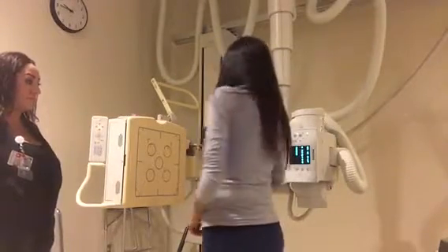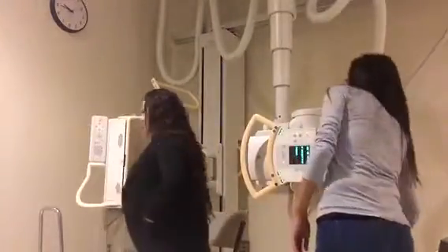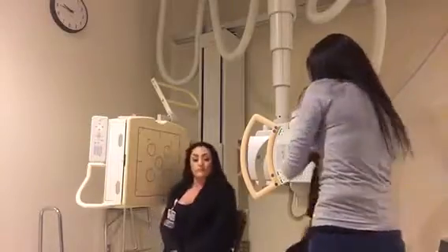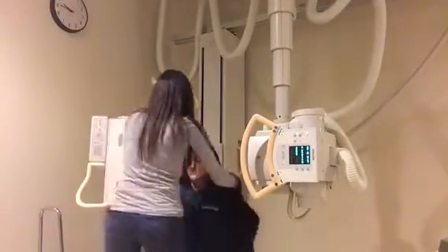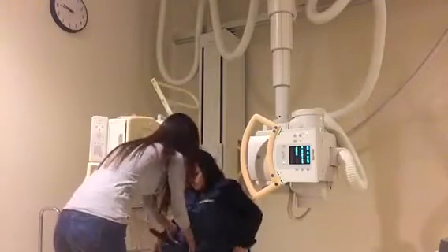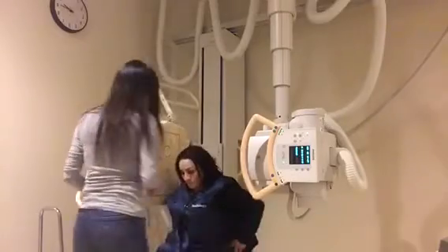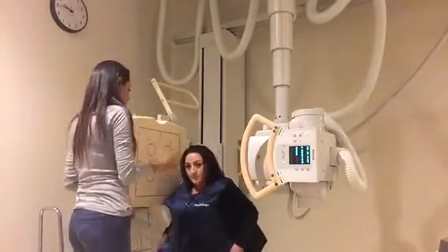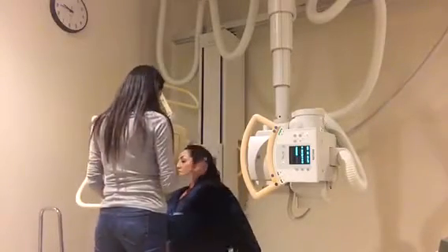Okay. So if you can just have a seat here on the chair. I'm going to go ahead and shield my patient. So if you can go ahead and just turn facing forward.